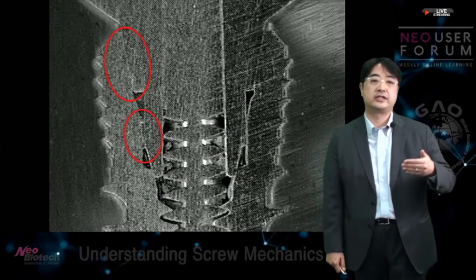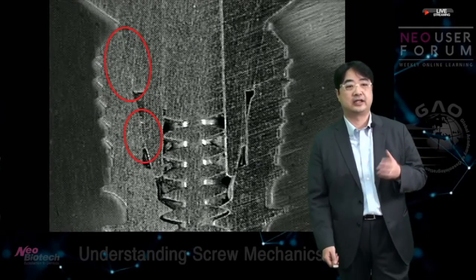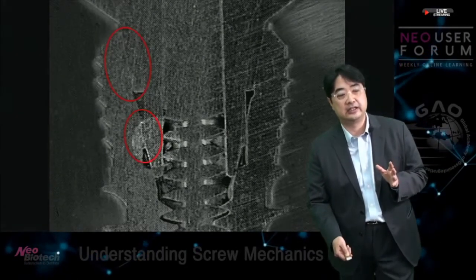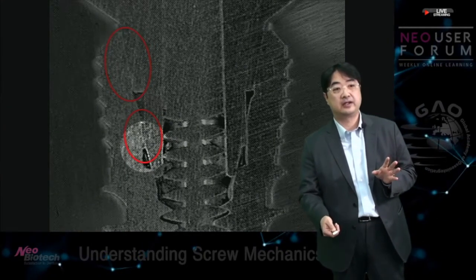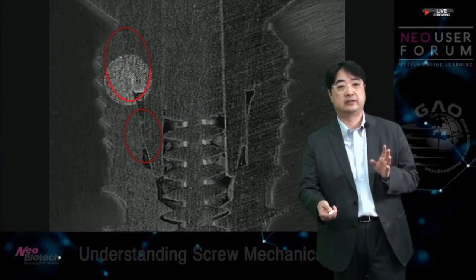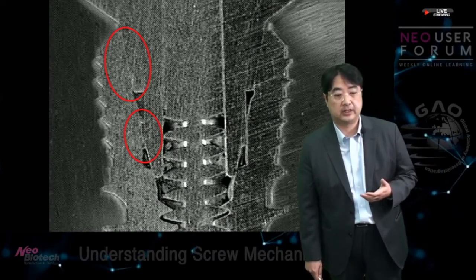Okay, so this is a picture when you put the abutment inside of the implant. If you place the hex abutment, then you may find these two contacts on the inside of the implant. The upper part is the abutment, and the lower part is the hex. So if you use the non-hex abutment, it means you only have one contact on top of the implant, right? So this is the picture of internal connection with the hex abutment, okay?